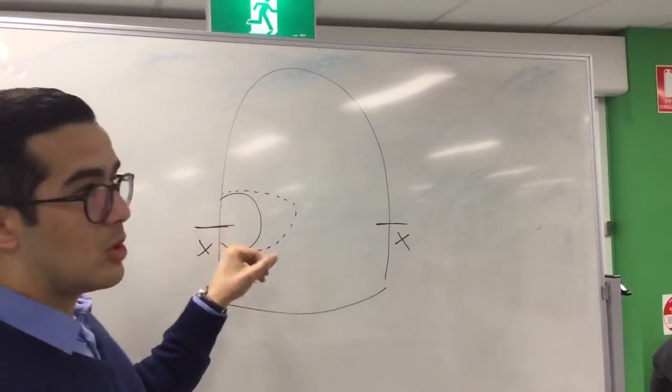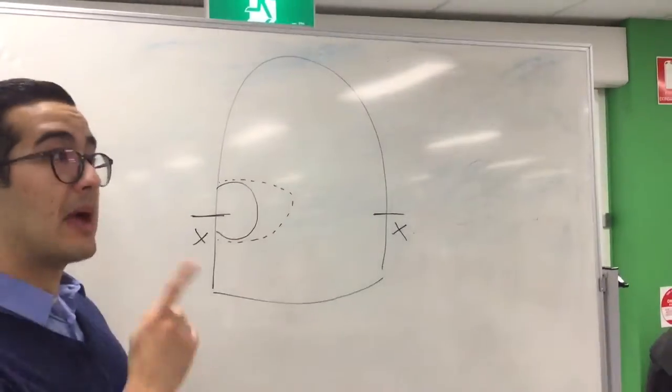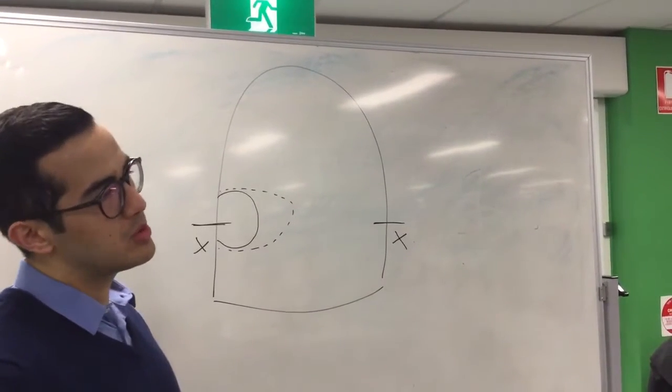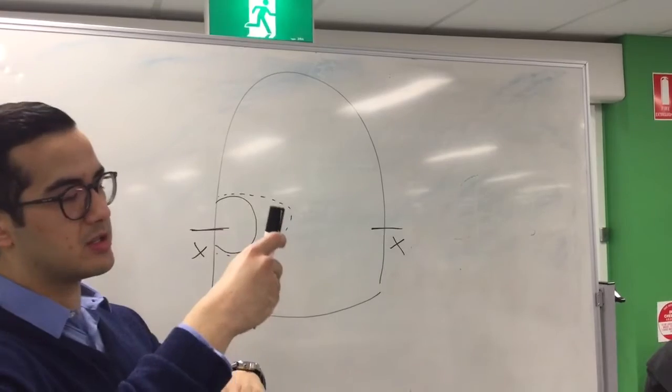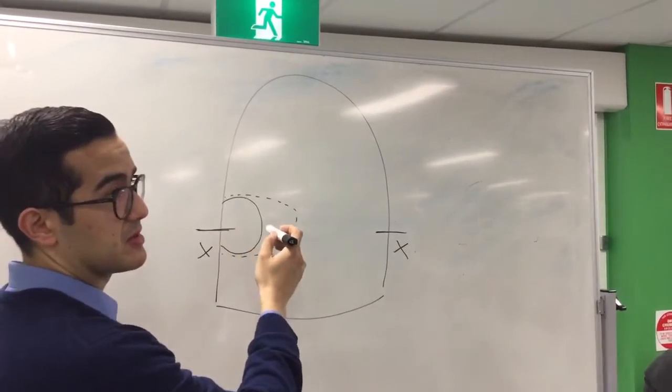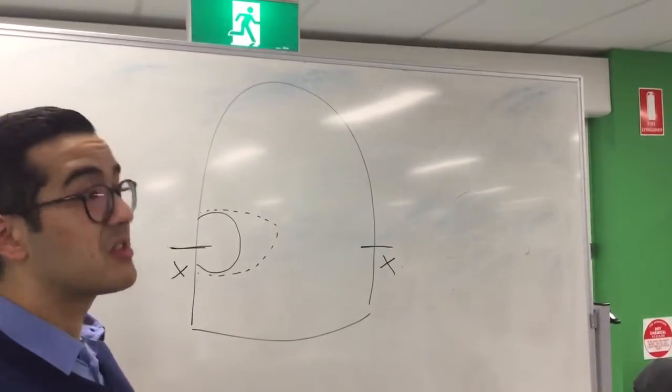So this would all be done, if it's on an upper, from the palatal aspect, okay? So you're always making sure... remember when we did the interproximals, we started perpendicular to the occlusal surface. Now you're perpendicular to the palatal surface. So you're going to be utilizing a lot of indirect vision.